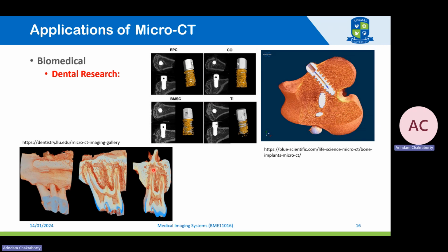We can also visualize the root canals and all other internal structures as well as the dentin and everything. So this is useful to understand the internal detailing of the tooth.